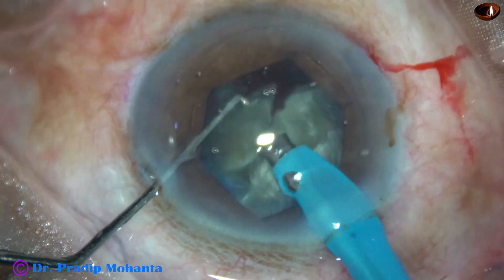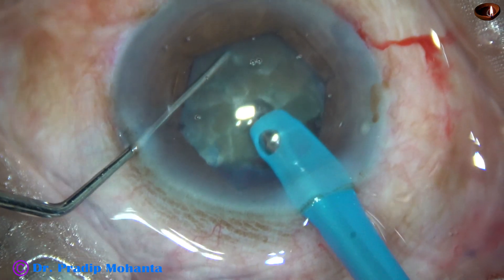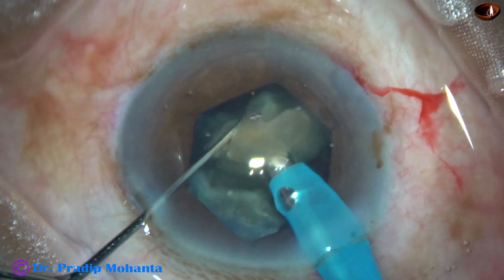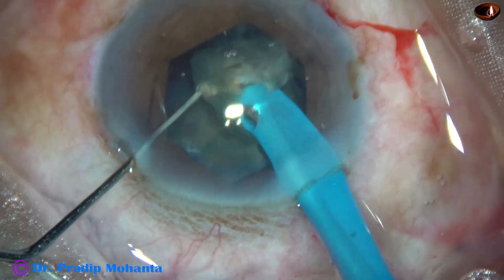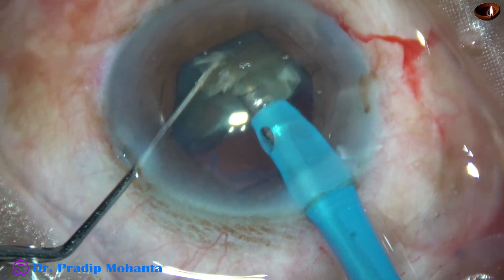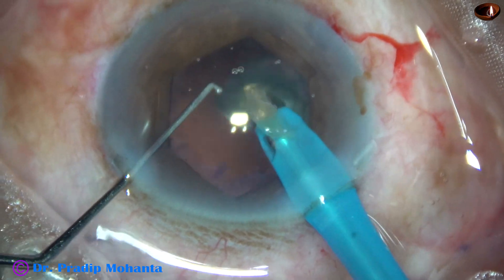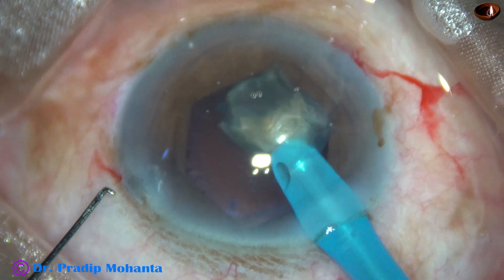This nucleus is not very hard — it is grade 3 plus or grade 4. This is the larger hemi-nucleus. It is divided into pieces. This is the endonucleus, and this piece is emulsified. This is the last piece. I am at 450 vacuum and 45 flow rate. Ultrasonic energy is set at 70%, but most of the time I am using less energy, which is being controlled by foot pedal.